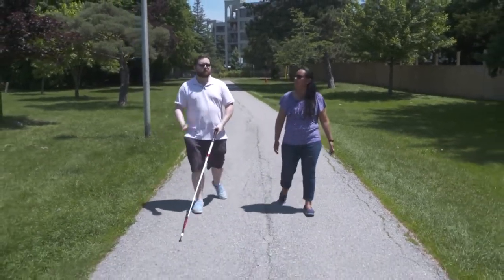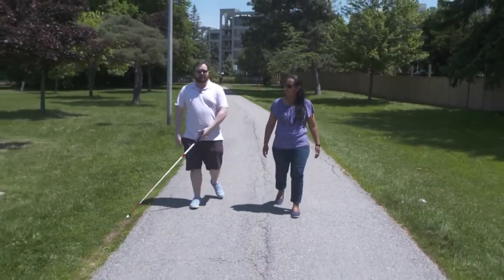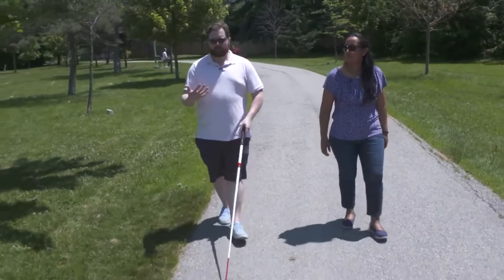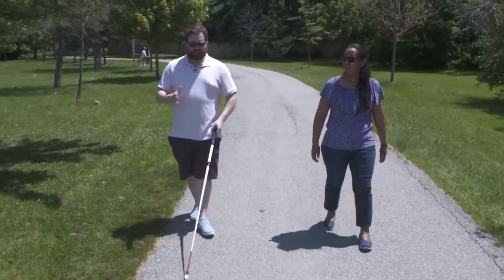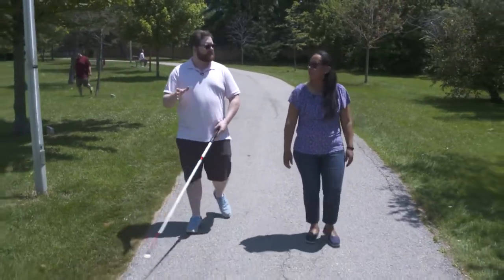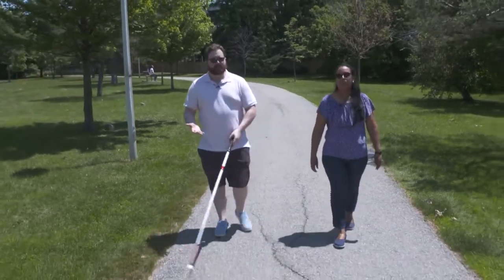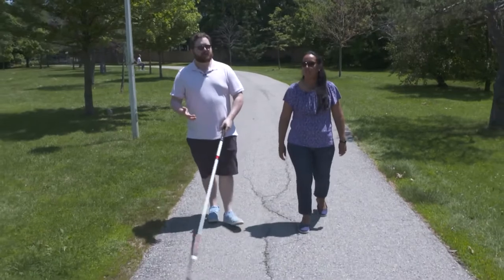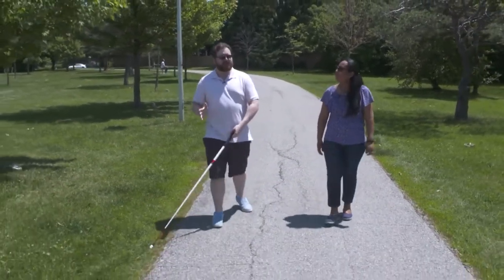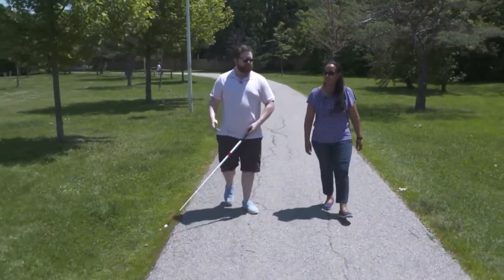Alex Smythe: Yeah, so I'm not just drifting over. There could be a cyclist coming behind me who thinks I'm going to stay on one side — unbeknownst to them and me, I drift over. What I've always done for myself when navigating is find other people and follow their path, because then I know that path is clear. I can still do what I'm used to doing, but now incorporate the cane to make sure there's nothing at my feet when I'm not seeing it.